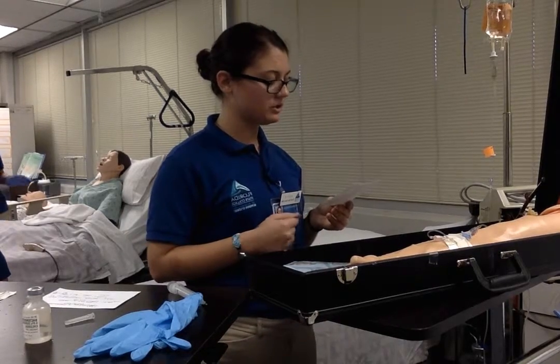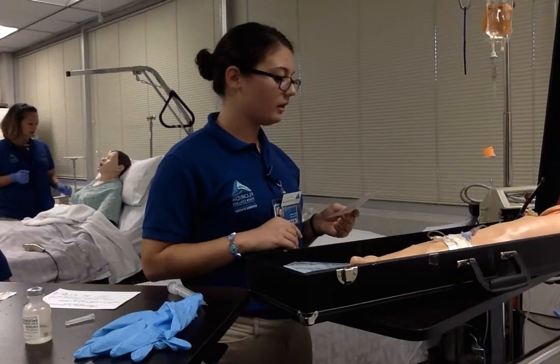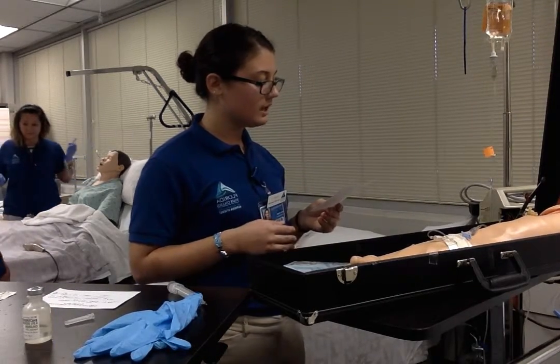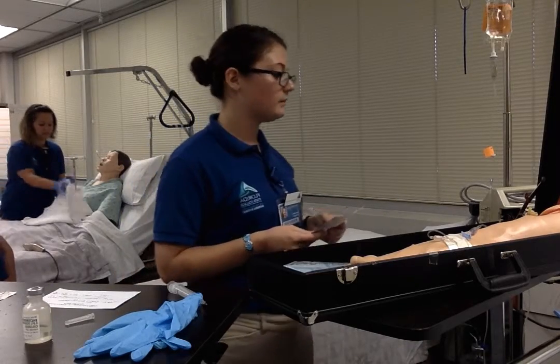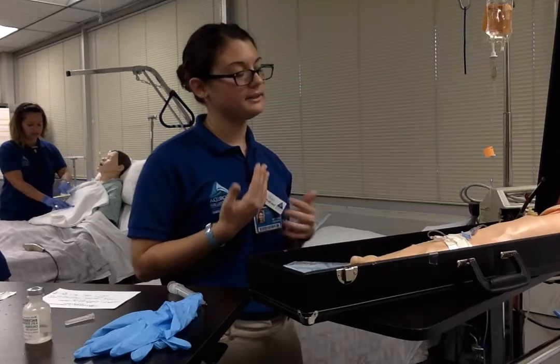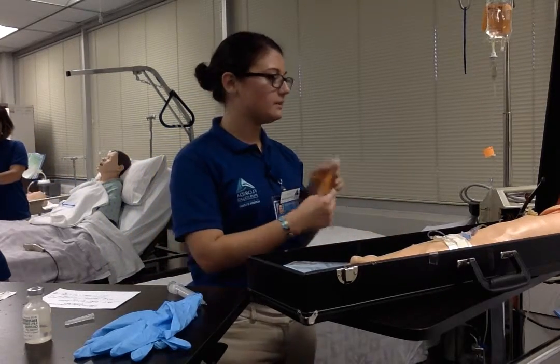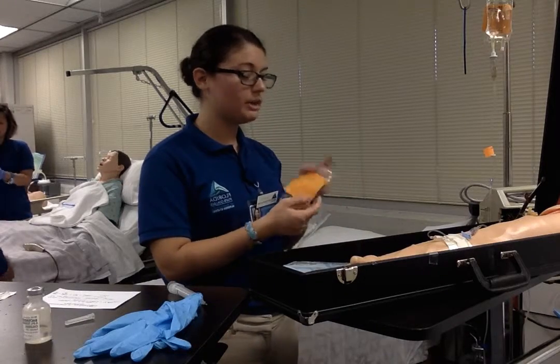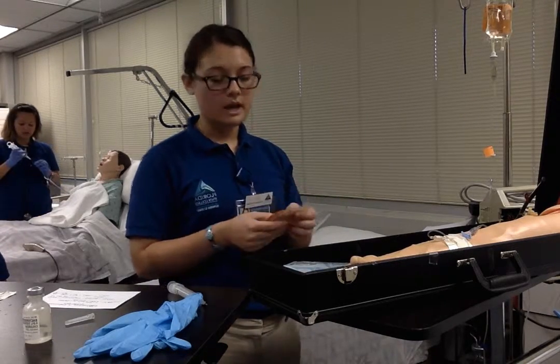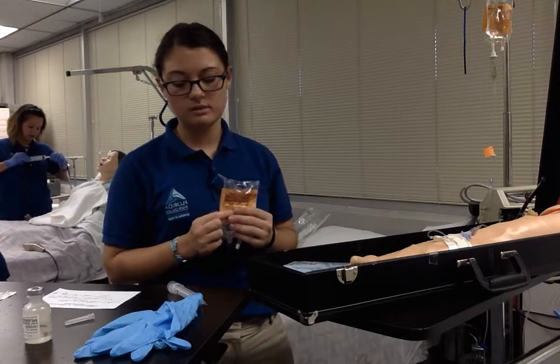So some of the side effects, just so you know, that we're going to look for and continue monitoring are ototoxicity, nephrotoxicity, a superinfection, and red man syndrome, just to name a couple things. So that's some things to look for. If you notice, please let us know. We're going to continue monitoring you for that. So again, I have prepped a bag here for you, which I have put the date, time, my initials, the patient's name, and the drug on here, so they know that there is something infused into the mini bag.